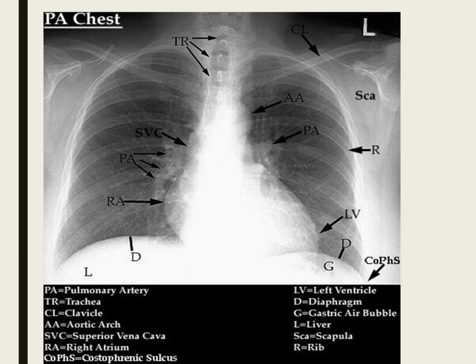The nurse asked me, hey, did you know the patient had an X-ray ordered 3 hours ago? Why do you want another one? Well, because I don't know what they did. What did the follow-up X-ray show at 2 in the afternoon? Still right mainstem intubation. So when you order an X-ray, it's important to look at the X-ray.